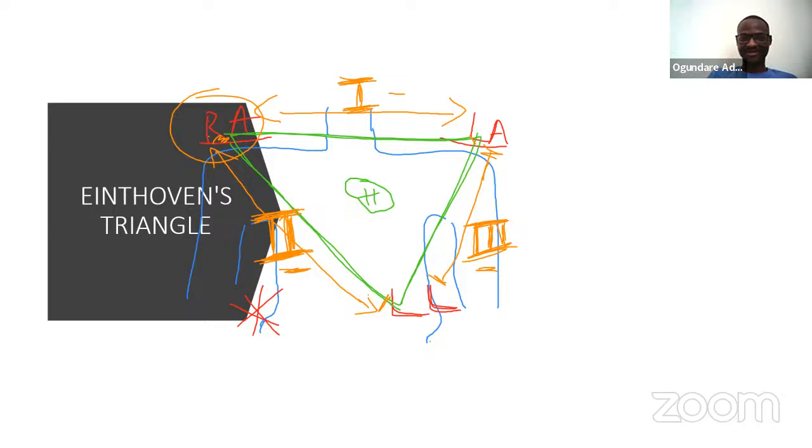Okay. So I've told us how lead 1, lead 2, and lead 3 are generated, and you can see that on the screen. Another thing you need to know is how the augmented leads are generated, and it's still the same illustration. So I remember I told us we have the heart in the center here.